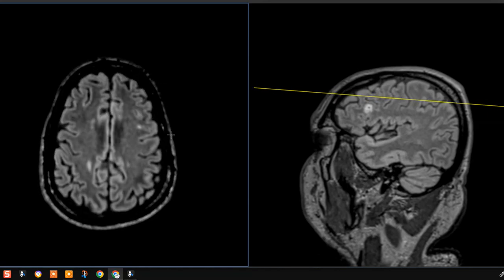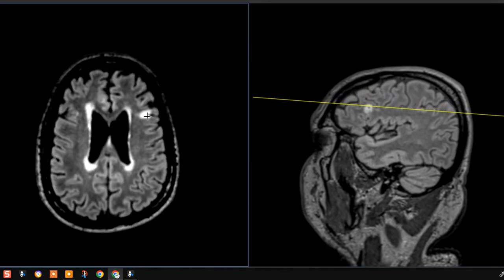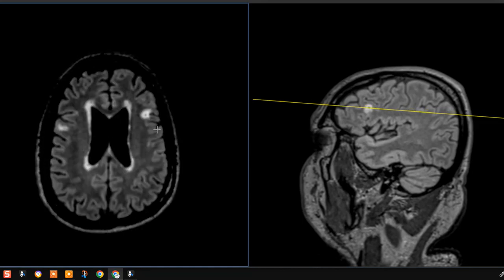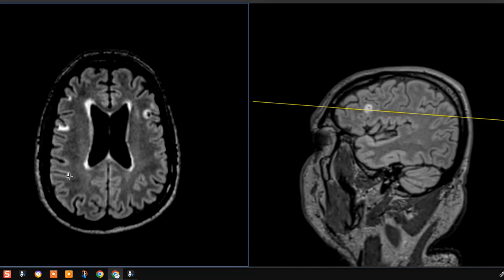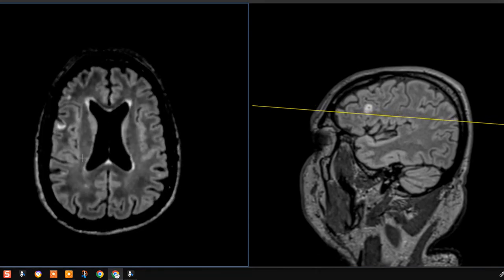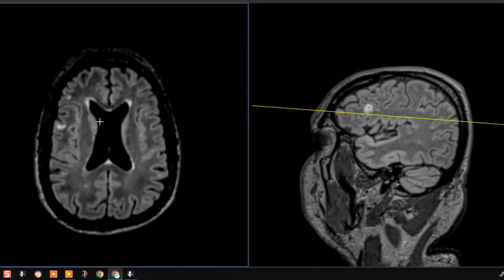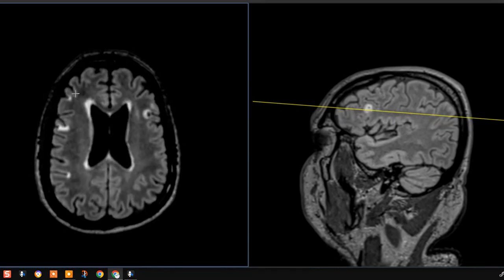Here's a lesion on the left — looks like a C-shaped lesion involving the cortex or cortex and subcortical white matter. Here's another lesion on the right, another small lesion back here more posterior, one here anterior, and as we go on down there's one over here. So this is a case of not only periventricular white matter disease but also cortical lesions scattered throughout.